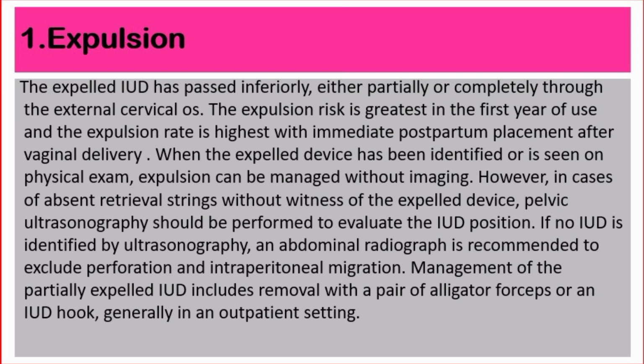When the expelled device has been identified or is seen on physical exam, expulsion can be managed without imaging. However, in cases of absent retrieval strings without witness of the expelled device, pelvic ultrasonography should be performed to evaluate the IUD position.